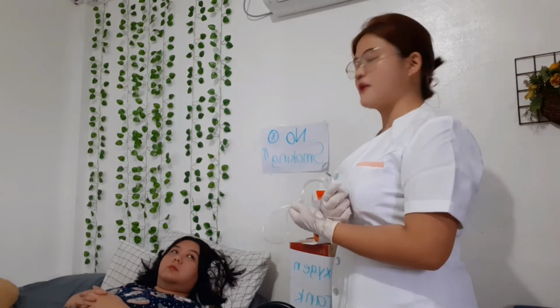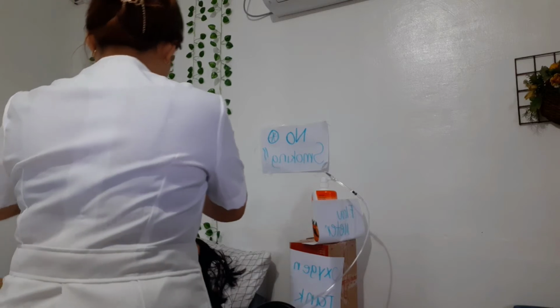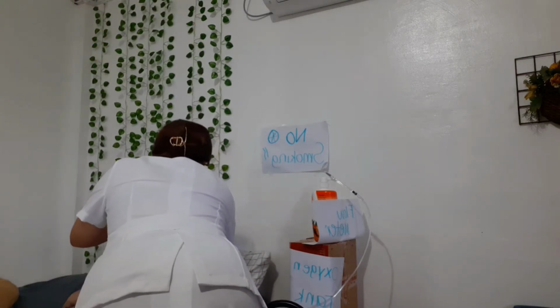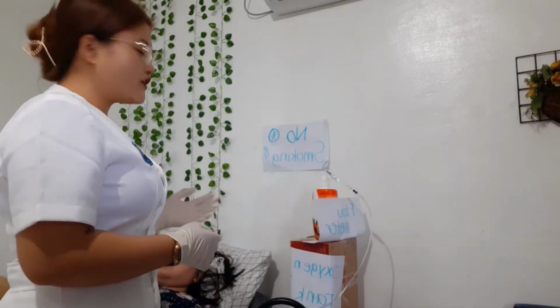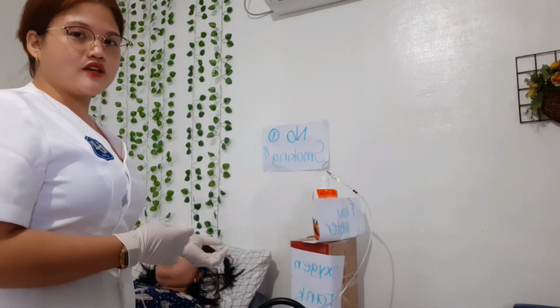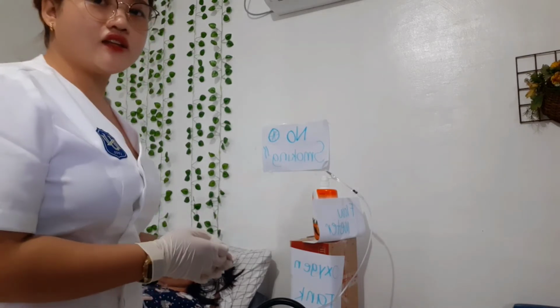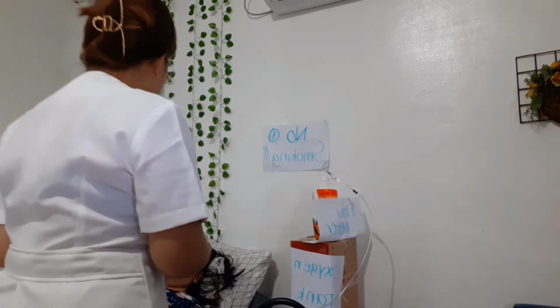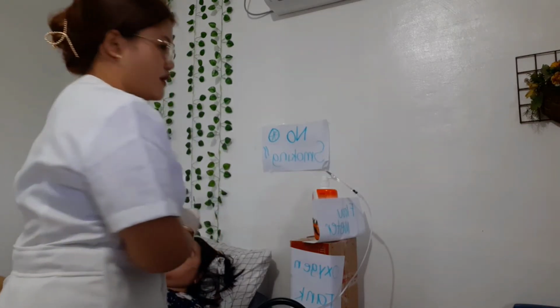So what is the rationale? It is to keep the delivery system in place so the patient receives the oxygen ordered. So I will place this one here. So after attaching the nasal cannula to the patient, you need to ask if the patient is comfortable or not irritated when it comes to the nasal cannula. So ma'am, hindi po ba kayo irritable sa nasal cannula? Okay lang po kayo? Okay, so thank you.